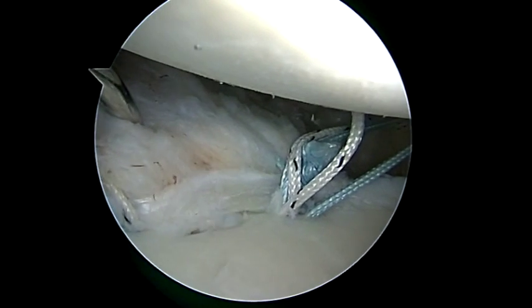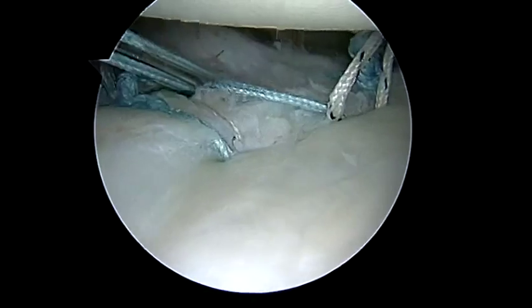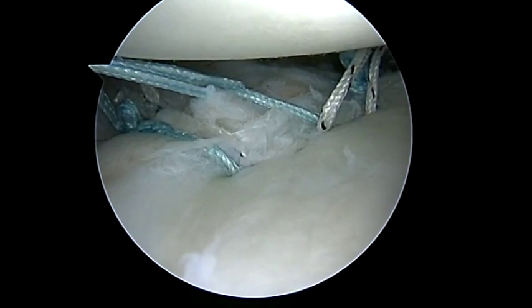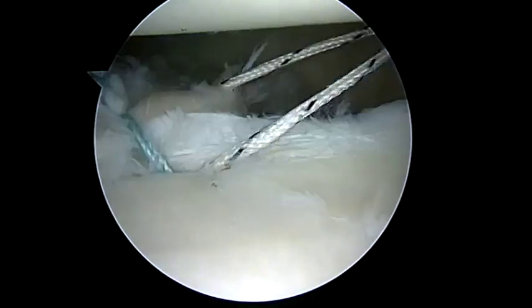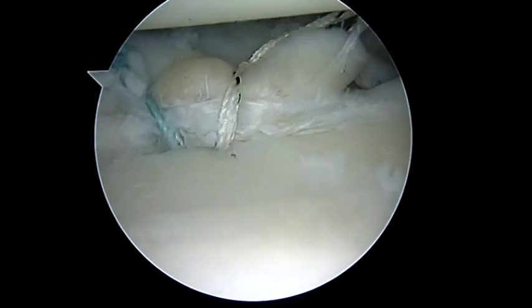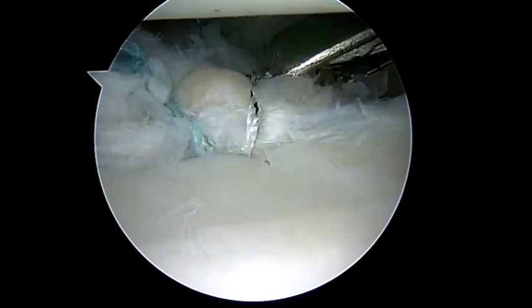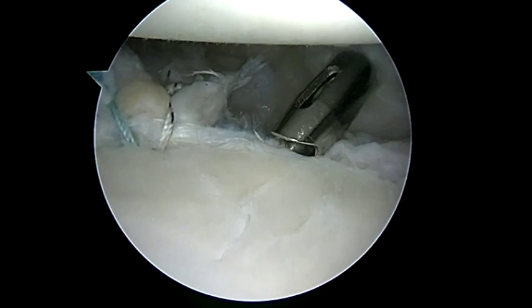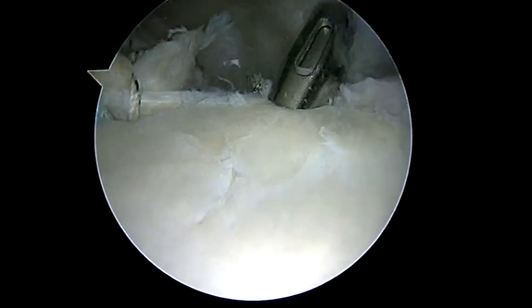The Spectrum is again introduced through the 7 o'clock portal and two simple stitches are placed, taking care to shift the capsular tissue in an anterior and superior direction. A third and final anchor is placed in the anterior-inferior glenoid, another 10 millimeters further up the glenoid face.